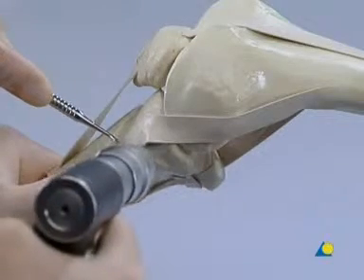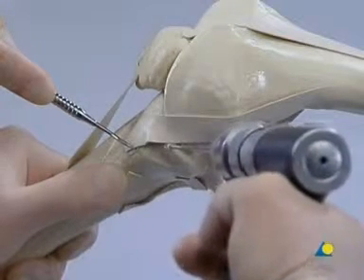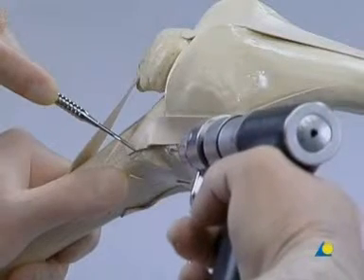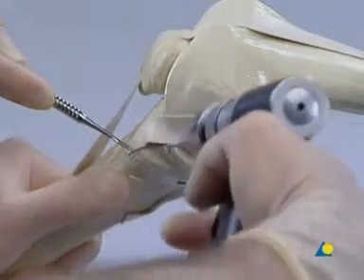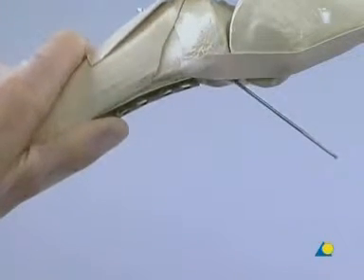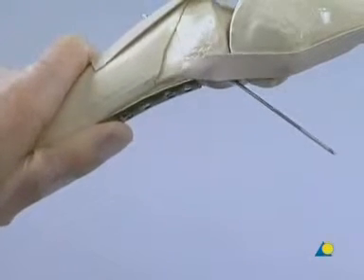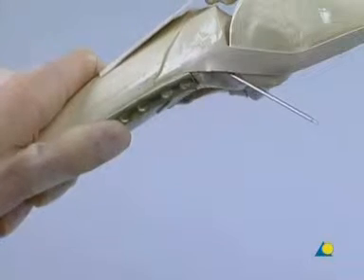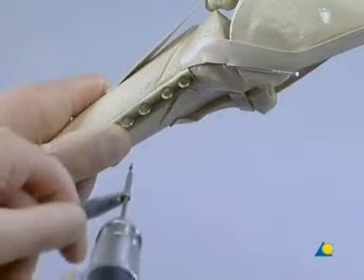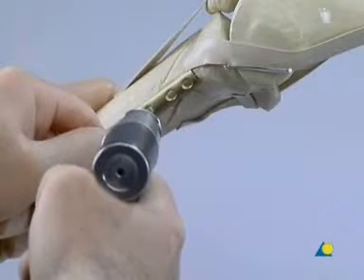Preliminary fixation is done by inserting a K-wire, begun close to the joint surface. The K-wire is then angled downwards so that it ends in the tibial shaft. A five-hole one-third tubular plate is positioned on the posteromedial crest of the tibia. Only minimal plate contouring is required, if at all. Next, a 2.5 mm hole is drilled just distal to the apex of the fracture using the appropriate drill guide.